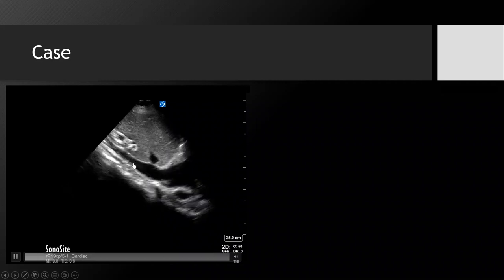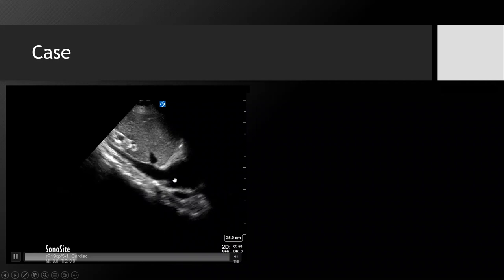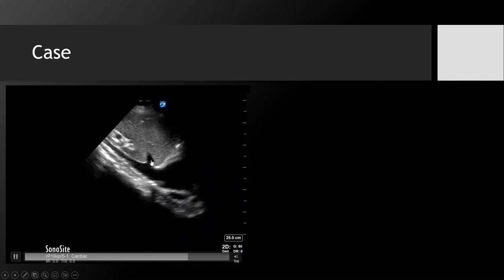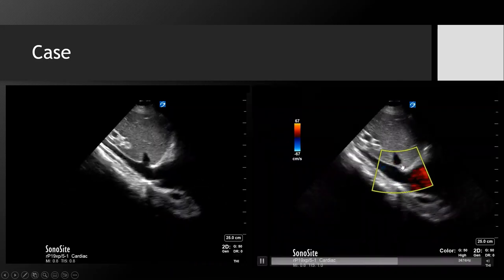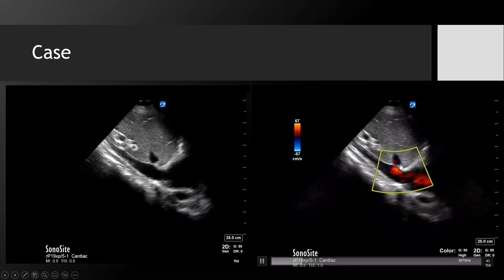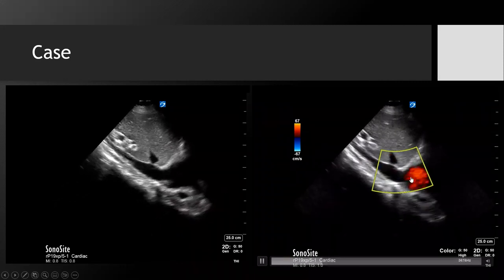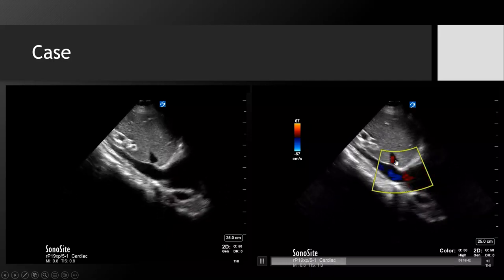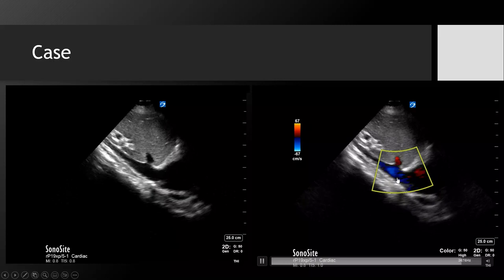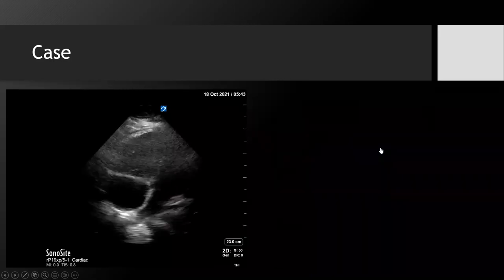You might see that the IVC looks like it's pulsating. You might ask yourself, is this the aorta? But it's not the aorta because you could see it falling into the RA. You can see the hepatic vein entering. This is probably some movement from TR. And again, we're not really talking about color today, but this blue flow that you're seeing occasionally in the hepatic vein, that's blood going backwards. It should only be red and going from the hepatic vein into the IVC, into the RA. That occasional bursts of blue, that's TR that's going retrograde. That's also probably explaining why it's having some of this bounding nature in the IVC.